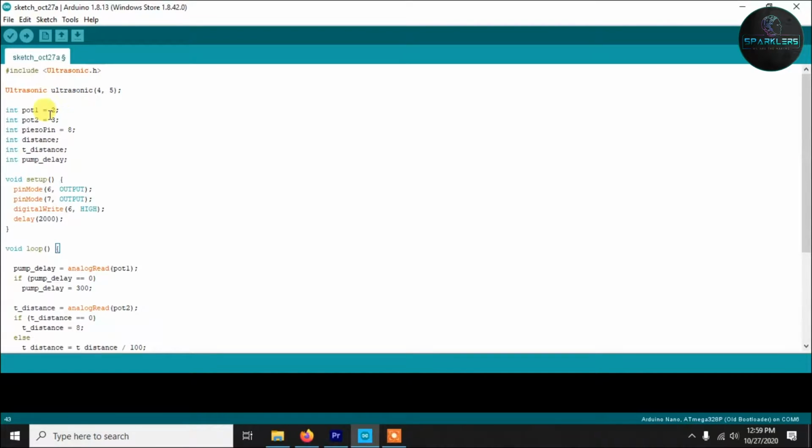Okay, then here I have initialized a few variables. Now port 1 is the potentiometer 1, and that is connected to analog pin number 2, and port 2 is the potentiometer 2, which is connected to analog pin number 3. Now the piezo pin is for the buzzer, which is digital pin 8, and now 3 variables just for future processing.